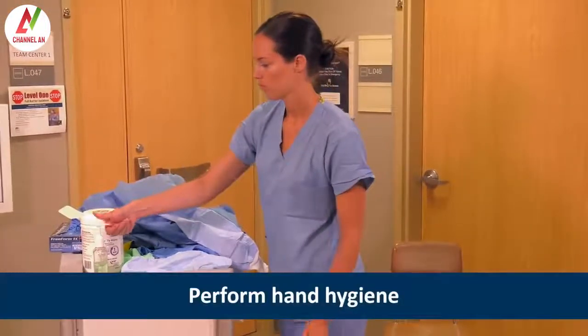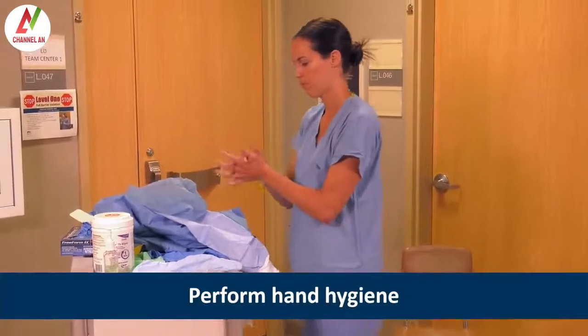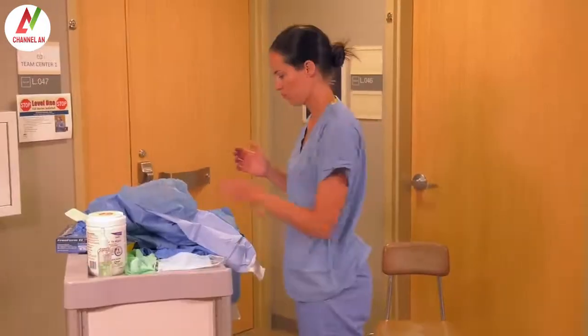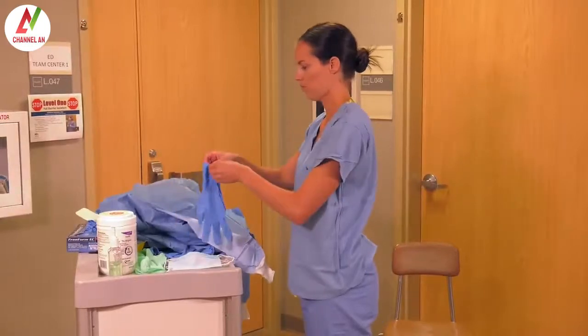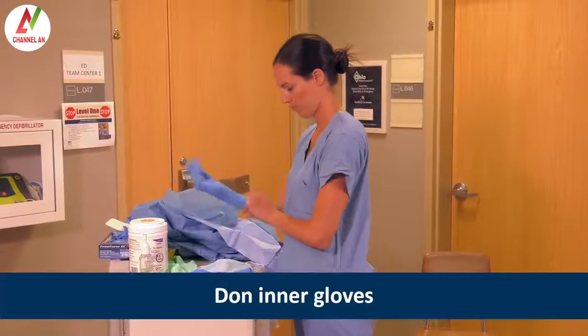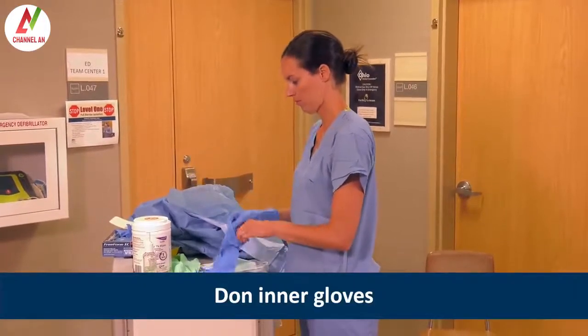She then performs hand hygiene with alcohol-based hand rub. Please note that the hand hygiene steps recorded throughout this demonstration are abbreviated for sake of time. Since Heather suspects a viral hemorrhagic fever, or VHF, she dons inner gloves with extended cuffs.